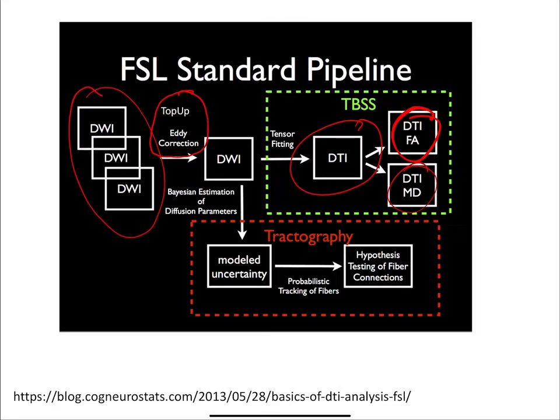I mean, if it's not too bad, maybe we can help do some processing on it. But in general, you want to take your data, and if you can go all the way through the analysis, that's even better. Because sometimes you may not see something until it's far in the analysis, and then something looks just a little bit off. So for diffusion imaging, definitely run it through till you can look at the FA maps, and if they don't look reasonable, then you need to say, hey, something's wrong.